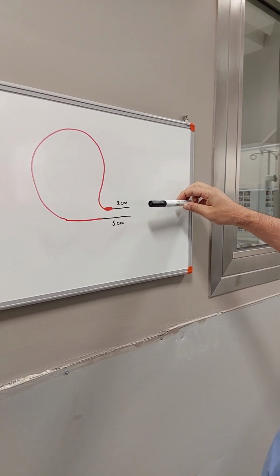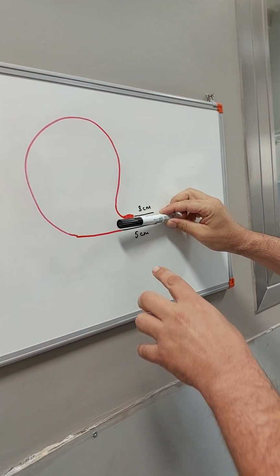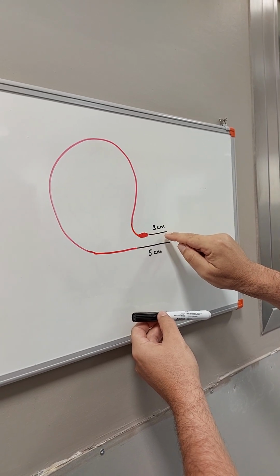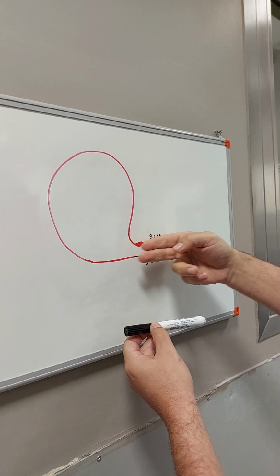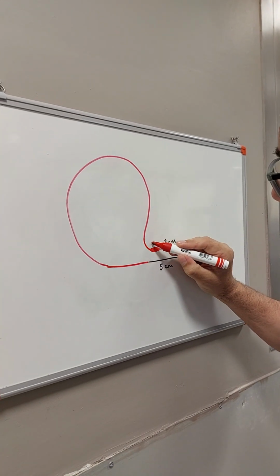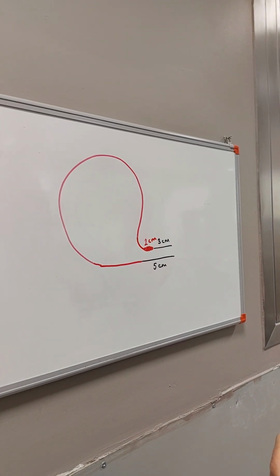Okay, when we go in with the rigid instrument, it is a thicker instrument, and now the upper part is 3 centimeters of urethra, and the lower part is 5 centimeters of urethra. When it is straight, the 2 centimeter part of the bladder moves into the urethra.